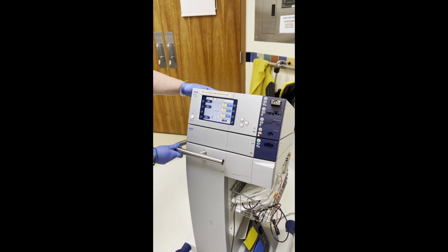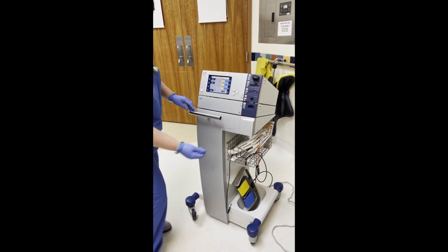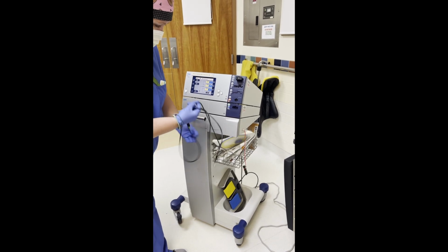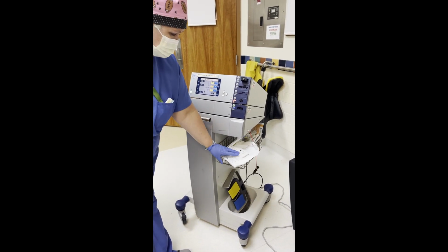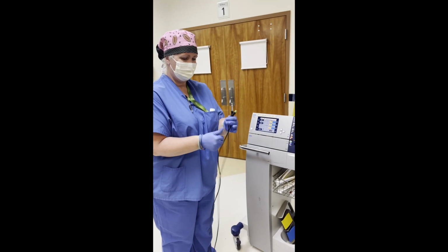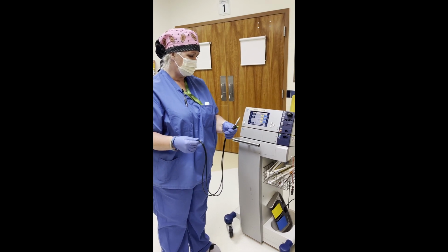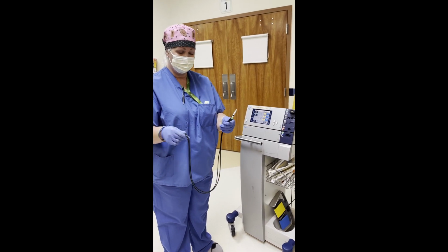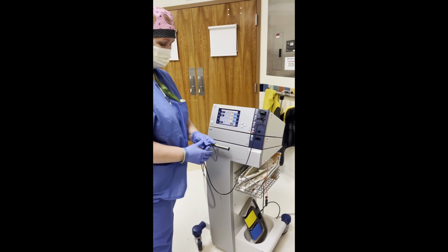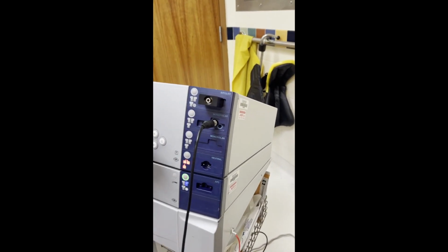Another thing about this machine, I want to show you what to leave alone. So this has been unplugged. This doesn't look like much of a cord, but this is very, very valuable. During an emergency procedure, you're not going to use this, but always have it plugged in right there, because there are a lot of things in GI that we need this for, and we only have one.